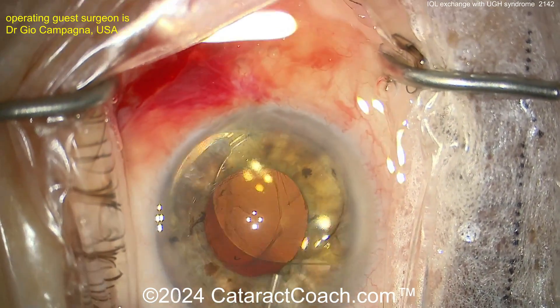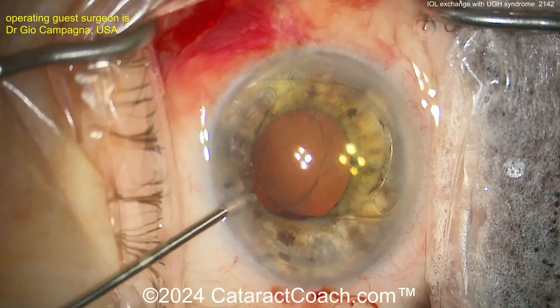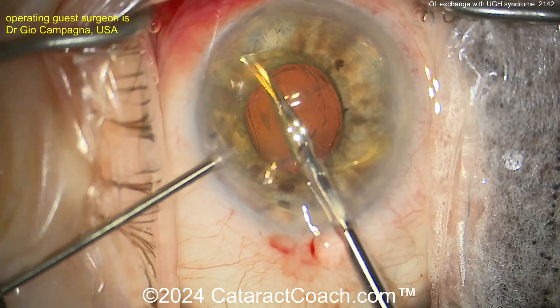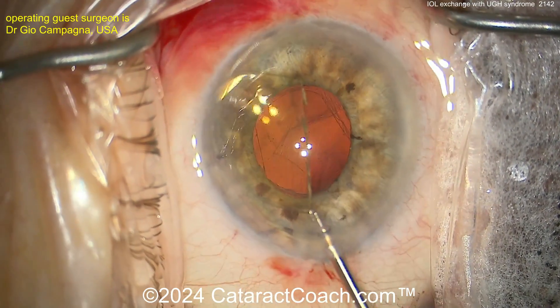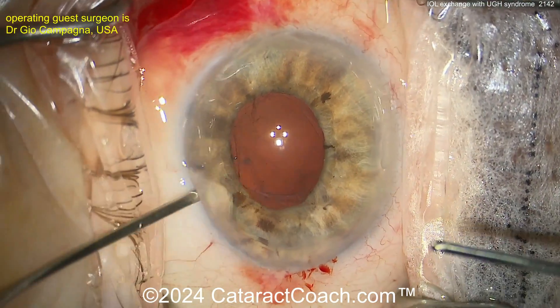A little more viscoelastic — always good to give yourself some room and protect that endothelium. Let's do a cut-and-out technique. Cut the lens in half — here it is bisected. A hint: don't cut it all the way in half. Cut it 90% in half, and then when you pull one half, the other half is still attached. It comes out kind of like linked boxcars.